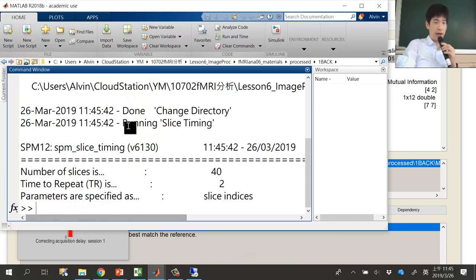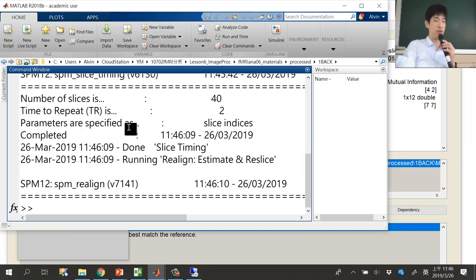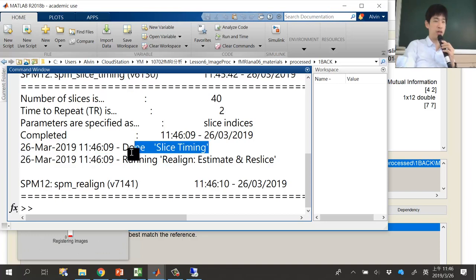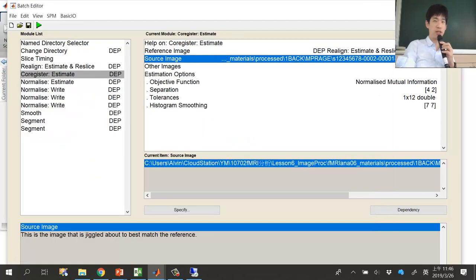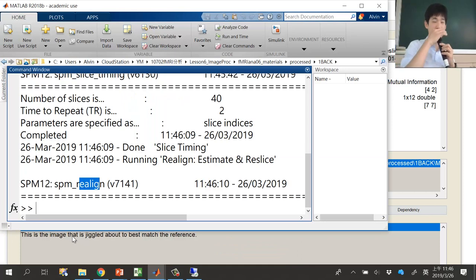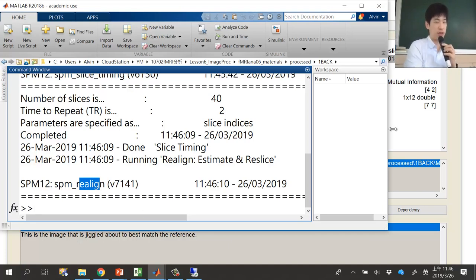Once you press the run button, you'll see the processing bar start. In the MATLAB command window you can see which step is currently running - for example, slice timing correction, then realignment. All steps will be processed sequentially according to the module list. Depending on your PC performance, it may take five to ten minutes for one case.